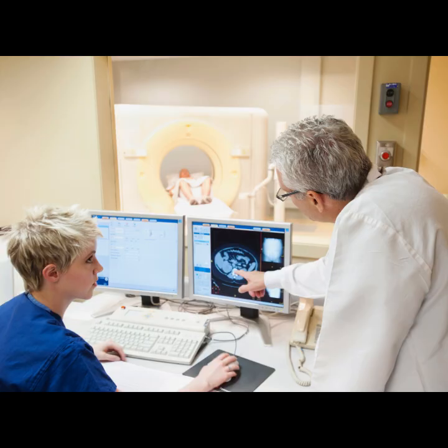As long as we precisely record where in K-space we sampled the data, which, let's be clear, we have to do anyway, regardless of the path, the image can be built in real time. This makes the need for a simple, structured path kind of obsolete, doesn't it? Complexity in the path doesn't necessitate slowness in reconstruction anymore.